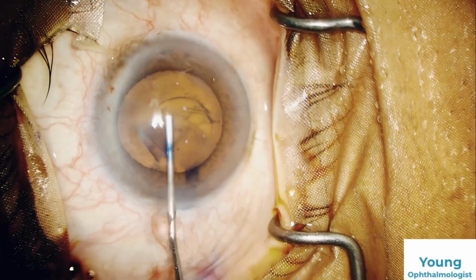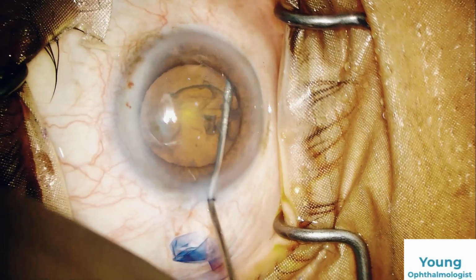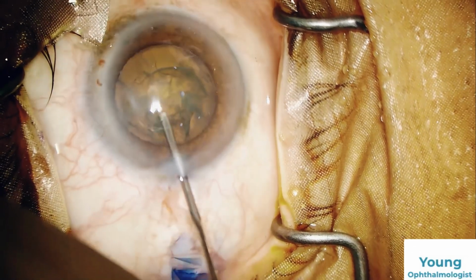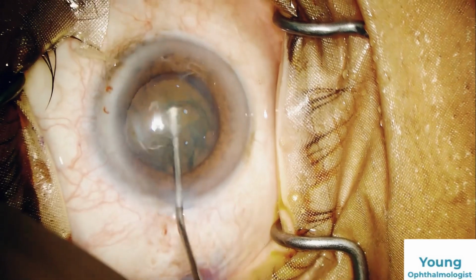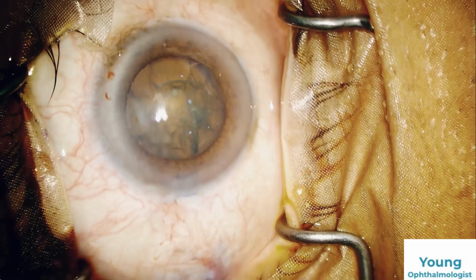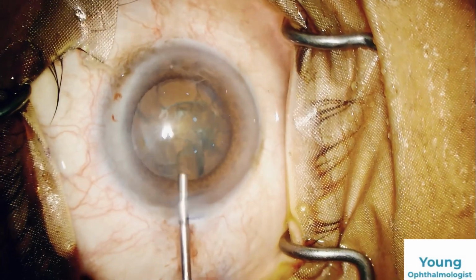Now time to do some AC lavage, doing hydrodissection, compressing the nucleus in between to relieve any pressure buildup behind the nucleus. Multi-quadrant hydrodissection is done. Pushing visco.